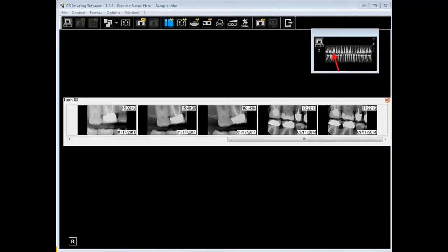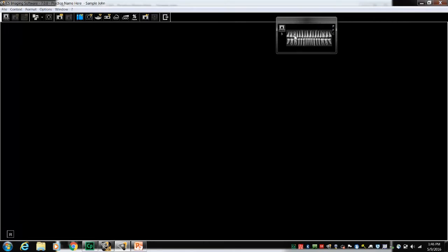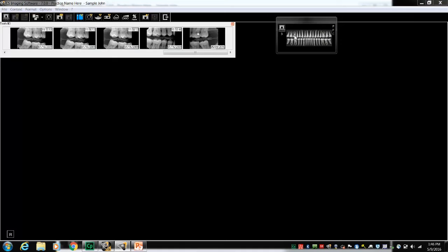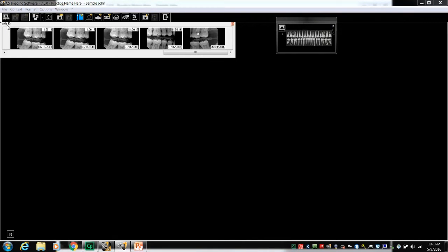Let's take a look. In the Dental Arch filter, we select tooth number 3. All images associated with that location are displayed. A single click on one image and a double left-click on the other, and all of the selected images will open.